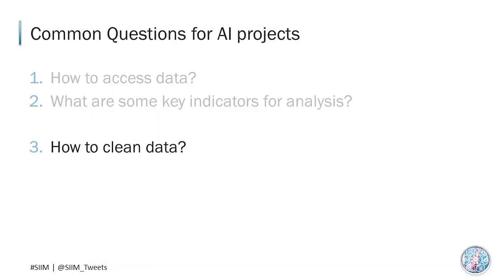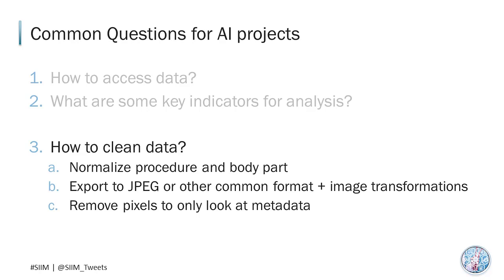Are there any standard methods to clean or normalize DICOM? That is actually a very broad topic. Here are a few things to get started. Since you may be getting DICOM objects from multiple sources, they often have different ways to capture procedure and body part information. So the first thing you may need to do is to normalize these contextual values.